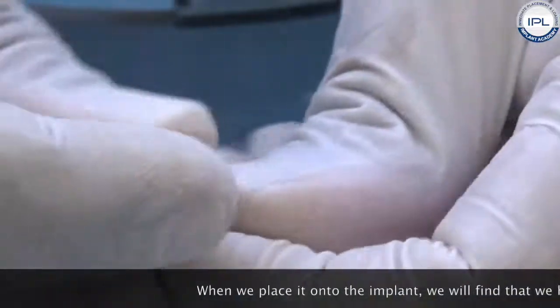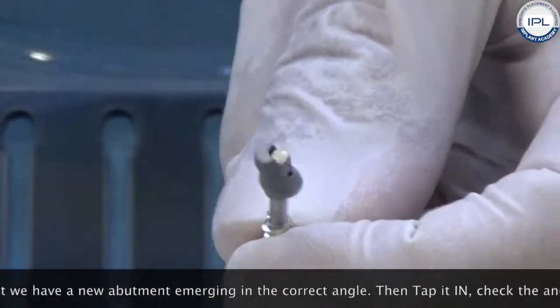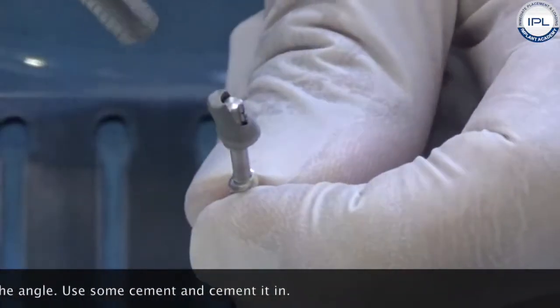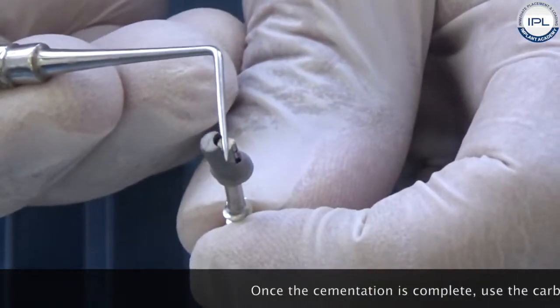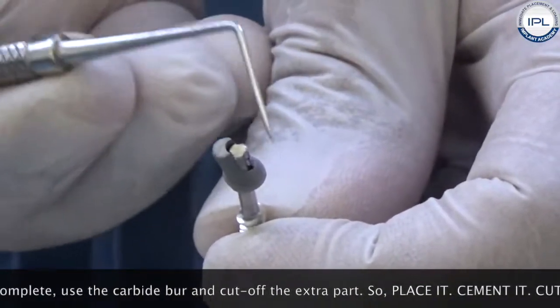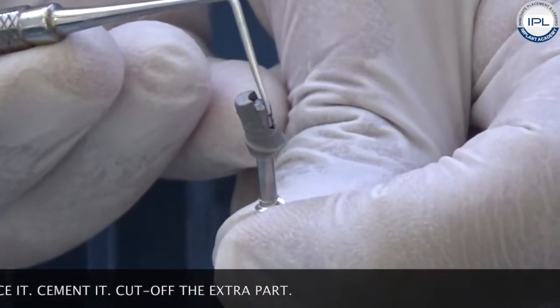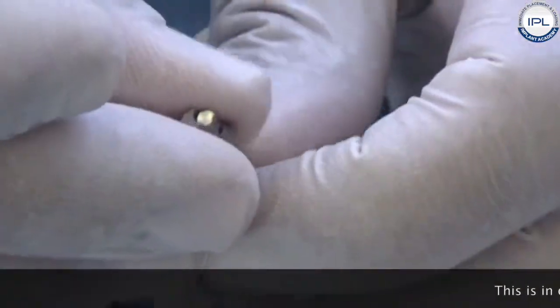What you will receive is a casted part like this. When you place it onto your implant, you now have a new abutment emerging at the correct angle. Tap it in, check the angle is correct, use some cement to cement it in, and ensure a good mechanical fit. Once cementation is complete, take a carbide burr and cut off the extra part protruding above.